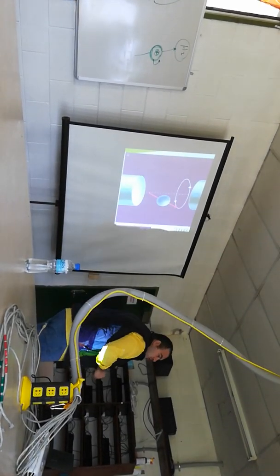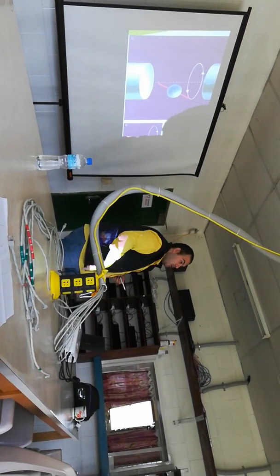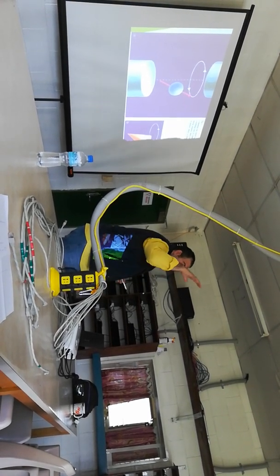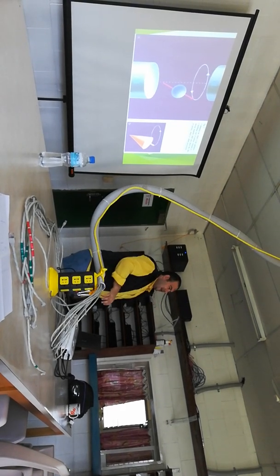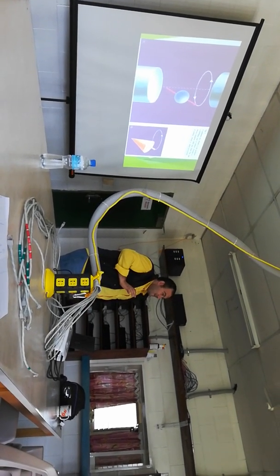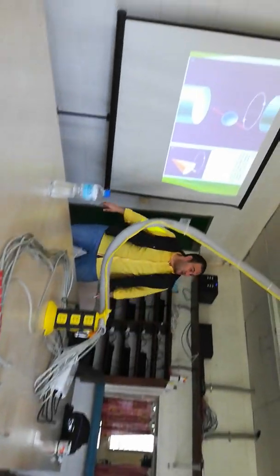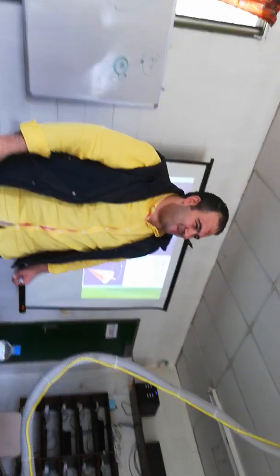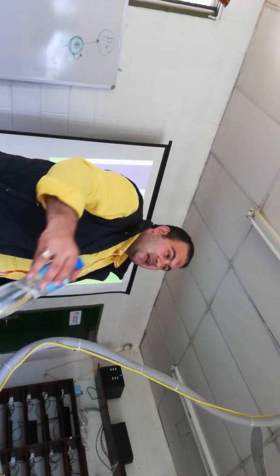But you will find that if 1,000,007 protons are pointing up, you will find only 1 million protons pointing down. So, what is the difference? 7. These 7 protons enable us to get the image. So, we excite all protons inside your bodies, okay, using the MRI machine.